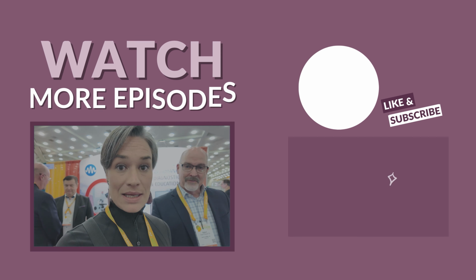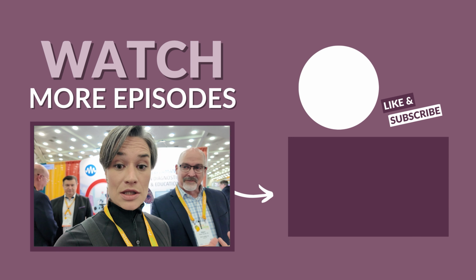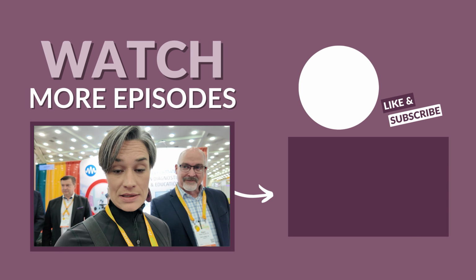This is so cool. It gives the power back to static images and to your microscope, because it used to be, oh, if you don't do whole slide imaging, then you cannot benefit from all the downstream AI and things like that. Well, there are going to be a lot of pathologists who will still work with glass, but they now have access to real life AI tools, different tools, and SmartyMedia partners with different AI companies. And they can basically do it while reading glass, which is super cool.